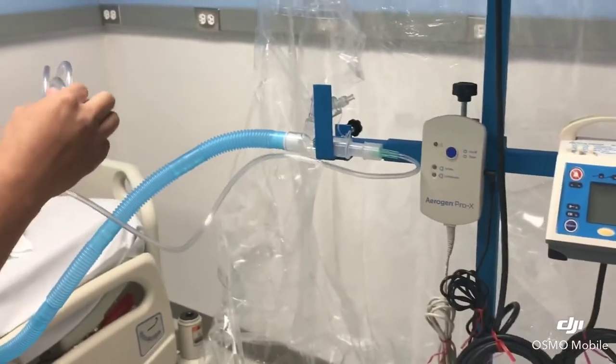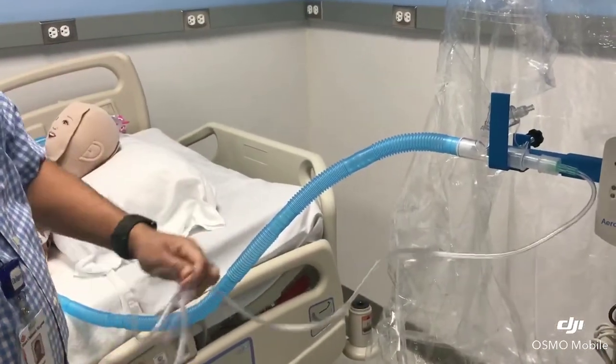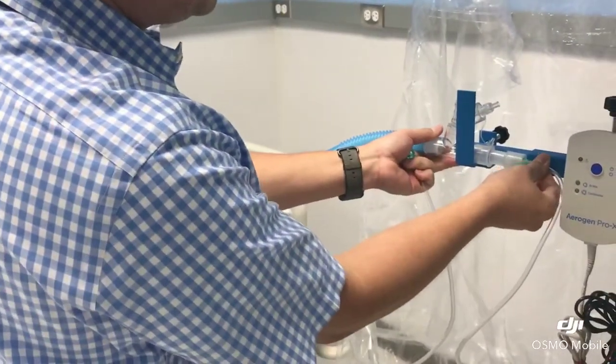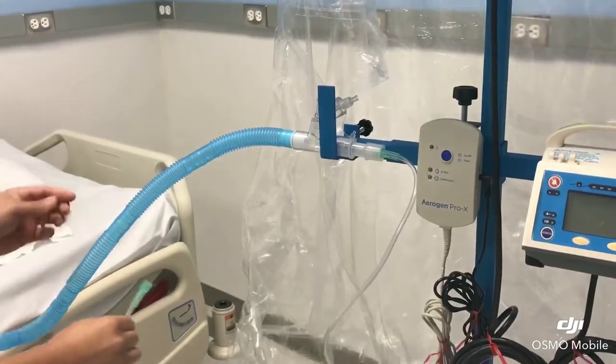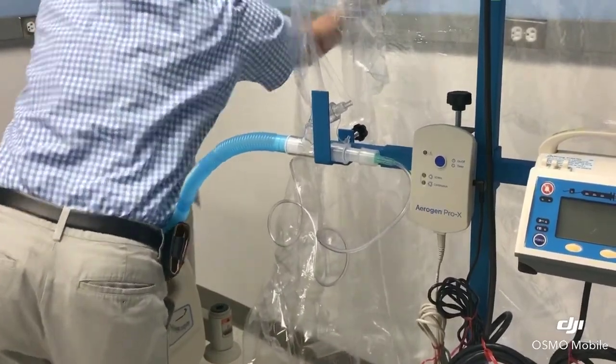So this is going to connect to the flow meter. If the patient needs oxygen, then you hook up to the oxygen flow meter. If the patient doesn't need oxygen, then you hook up to the air flow meter. So for now I'm going to set it up to the air flow meter.